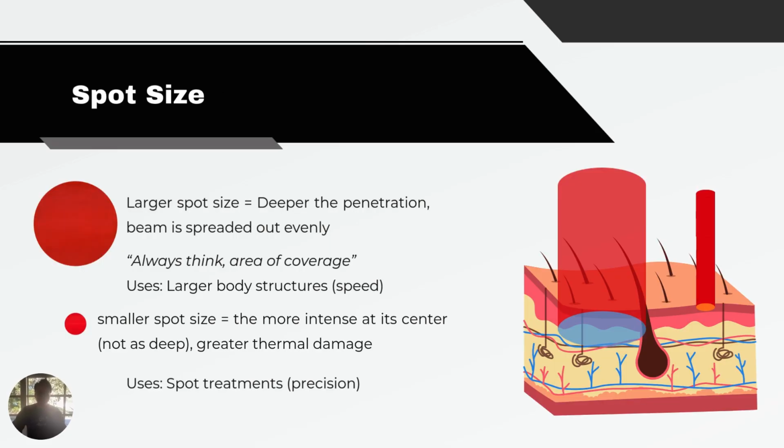Another important parameter that's misunderstood is the spot size. Keep in mind, the larger the spot size, the deeper the penetration. Refer to the left figure here on the skin. You see it's uniformly distributing the beam, hitting lower down the dermis area, while you have a very small spot size, which is intense and creates greater thermal damage.